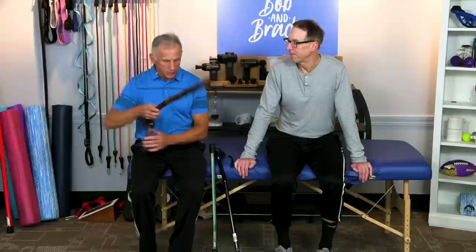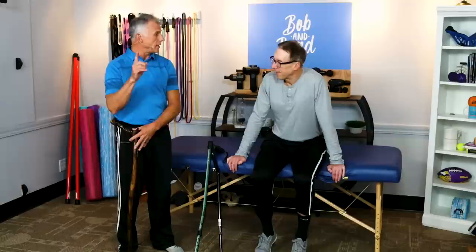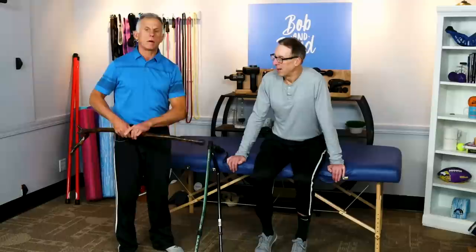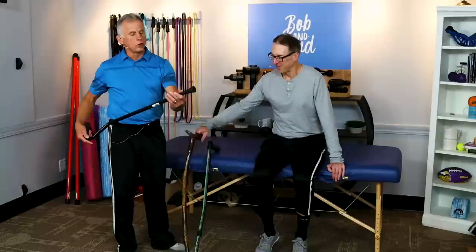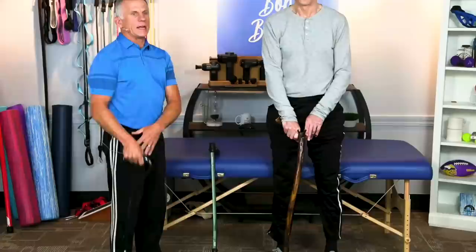Now the next thing is to adjust the height — very critical. If you have a wooden cane, stand up tall and put your hand down: the grip should line up with the crease of your wrist. With a wooden cane, if it's too long, take the rubber tip off, cut it to the right length, and put the rubber tip back on. Check twice, cut once. Most aluminum canes are adjustable up and down by pushing a button. Get the cane adjusted properly — absolutely vital.